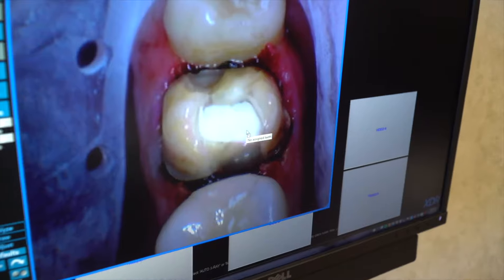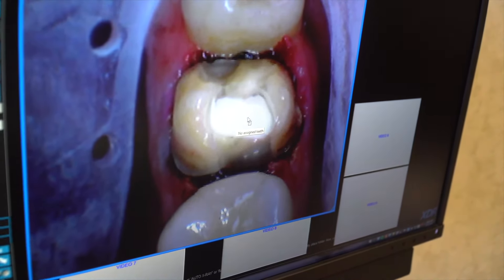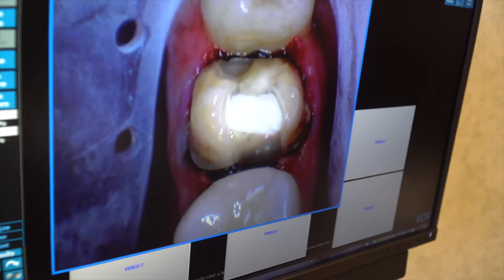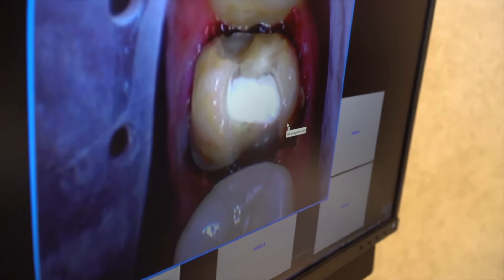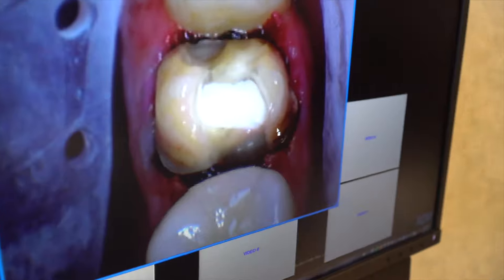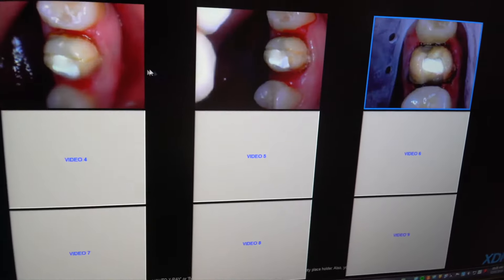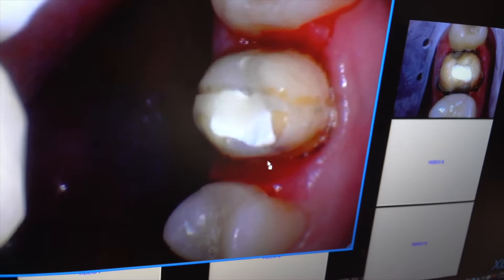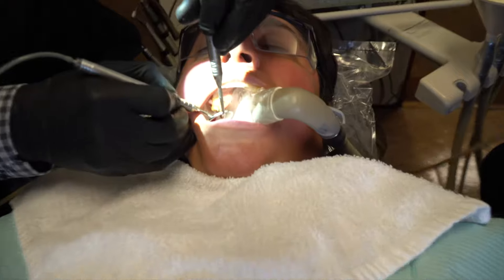We removed the decay and there's some old buildup in there, so we're going to do a new buildup and then proceed to designing the crown. That's where we took it off — that's the decay, old filling, old filling. We're using air abrasion to clean off the tooth.